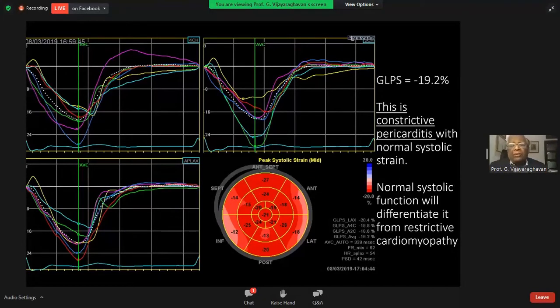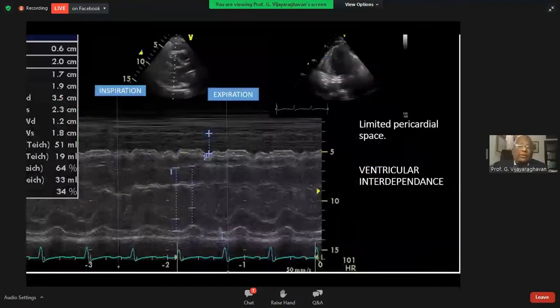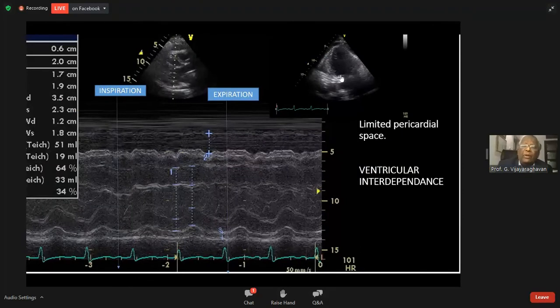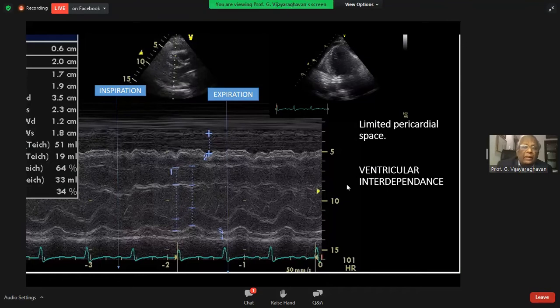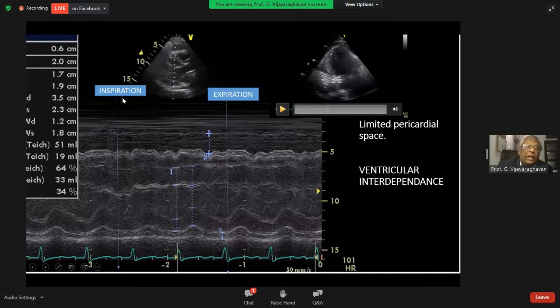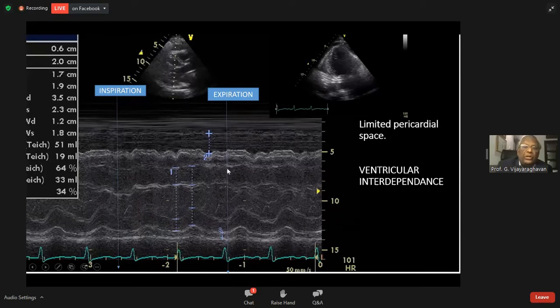Look at the ventricular interdependence. When you look carefully, you find that the ventricles change in relation to respiration within a limited space. In inspiration, the right ventricle dilates and the left ventricle is small. In expiration, the right ventricle is small and the left ventricle is dilated.